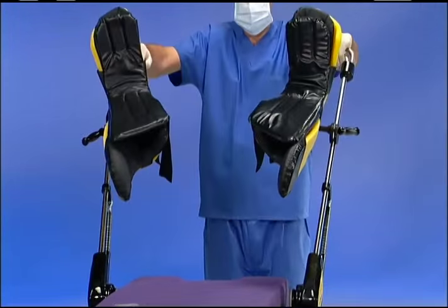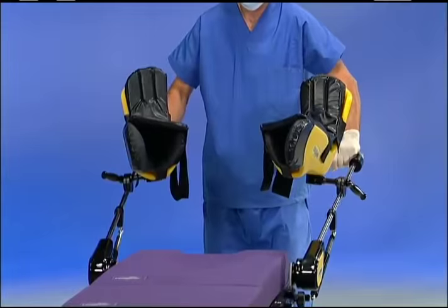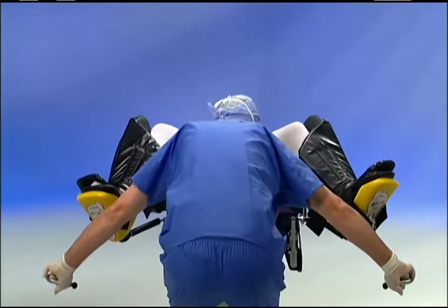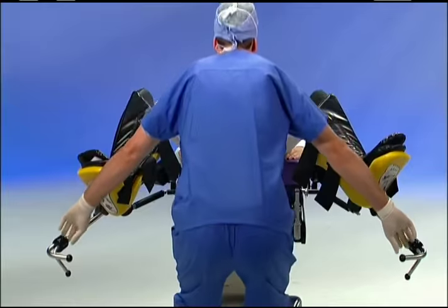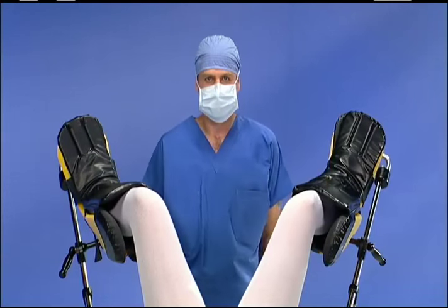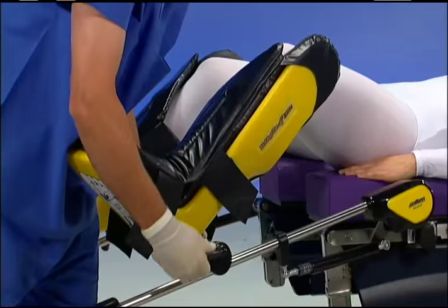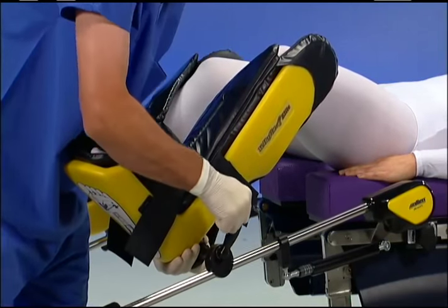The patented lift assist technology enables use of a single handle to adjust the degree of flexion, extension, abduction, adduction and rotation. Face the patient and grasp the lift assist handle — this unlocks the stirrup rod. By squeezing the lift assist handle, you can manipulate the stirrups. When you have reached the desired position, release the handle to lock the stirrup in all directions. The handle locks automatically even if accidentally released. To manipulate the boot, lend support underneath the boot with your medial hand and use your lateral hand to loosen the boot lock handle.